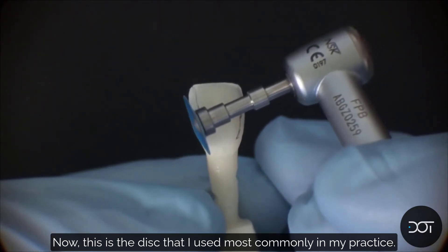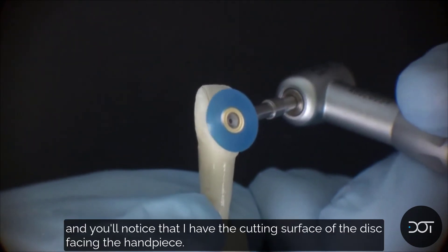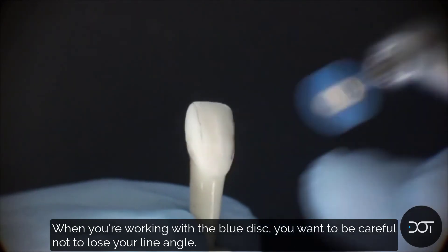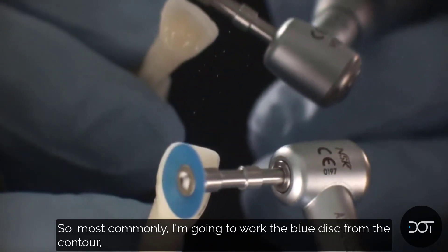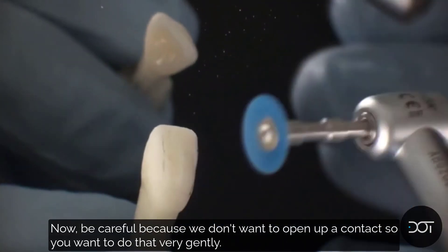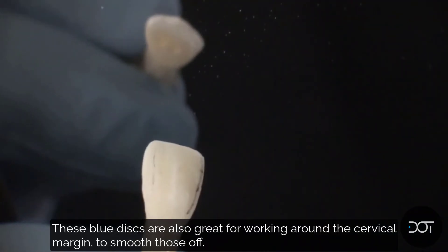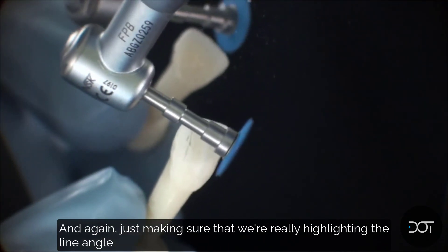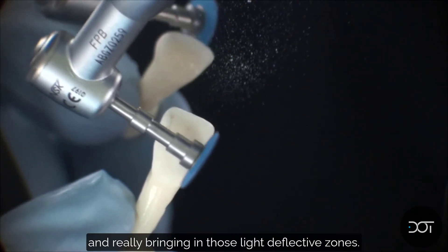The blue disc is the one I use most commonly in my practice. I especially use the small blue disc, and you'll notice that I have the cutting surface of the disc facing the handpiece. When you're working with the blue disc, you want to be careful not to lose your line angle. Most commonly, I'm going to work the blue disc from the height of contour just gently in to the proximal — being careful not to open up a contact. These blue discs are also great for working around the cervical margin to smooth those off. Just making sure that we're really highlighting the line angle and bringing in those light deflective zones.